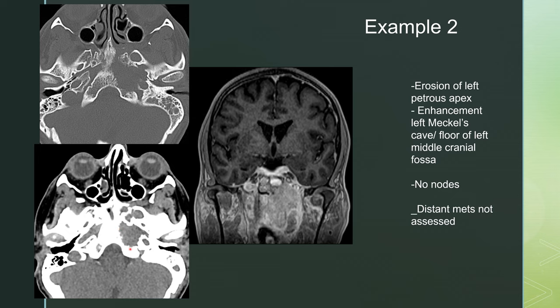In this location, you want to get an MRI with contrast to evaluate for intracranial extension. Here's the enhancing nasopharyngeal soft tissue mass in the left nasopharynx. What you're looking for is subtle intracranial extension — you can see thickening of the infralateral wall of Meckel's cave on the left compared to the right, as well as nodular thickening and enhancement of the dura in the inferior aspect of the middle cranial fossa. This is considered intracranial invasion, so this case is upstaged.